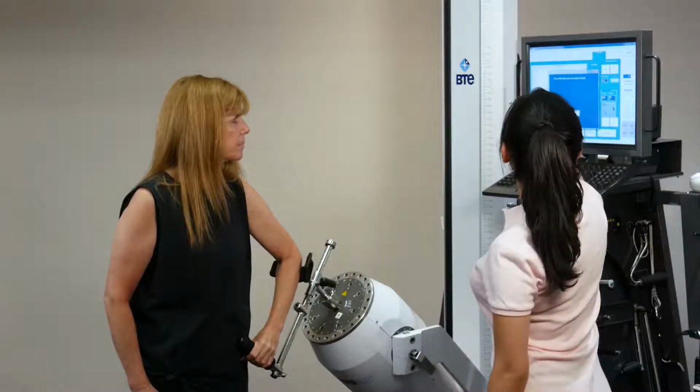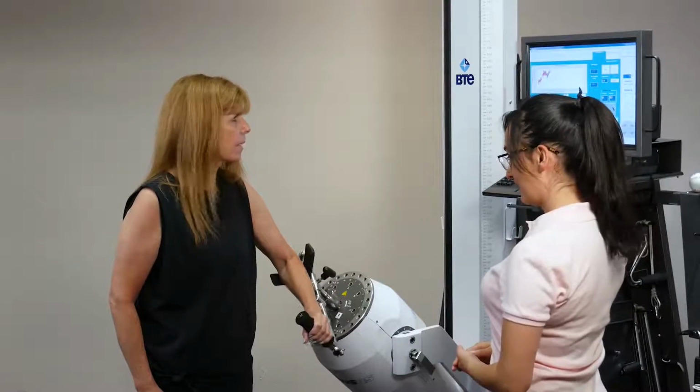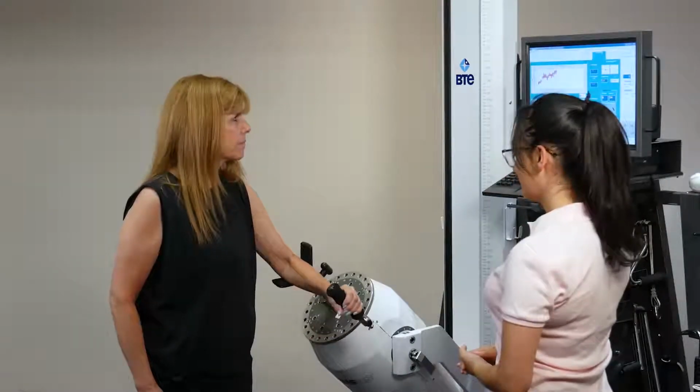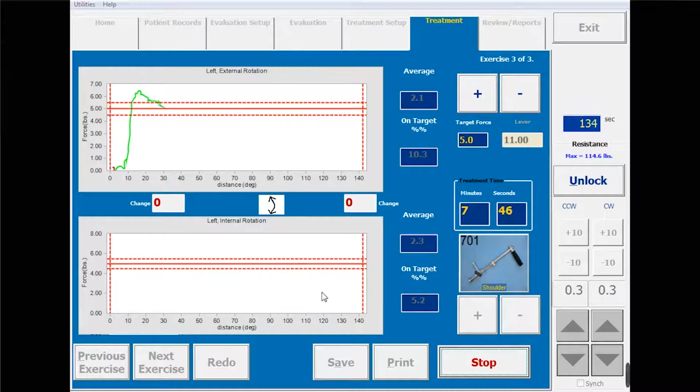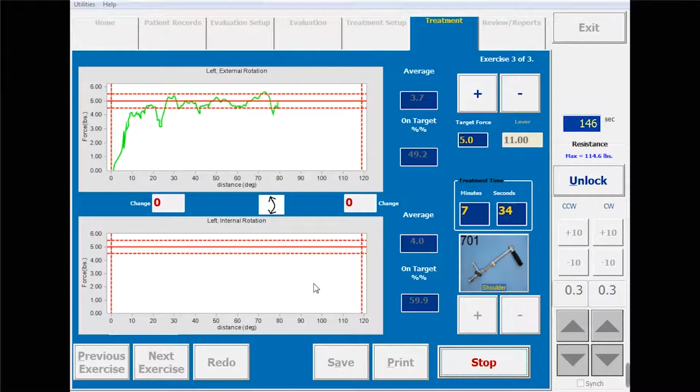The Primus will provide assisted movement through the defined range of motion. The system does not actually exert force on the client, but it measures the force that the client generates through the assigned range of motion and their ability to stay inside the target force range. The target force indicator is here on the screen, so the client can maintain their force within the target zone. The green line shows when the client is pushing in the same direction as the Primus. The red line shows when they're pushing against the direction of movement.